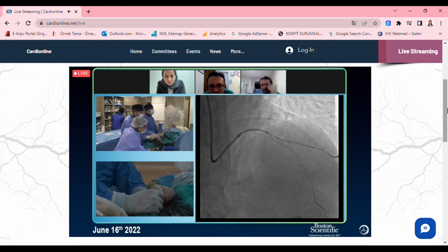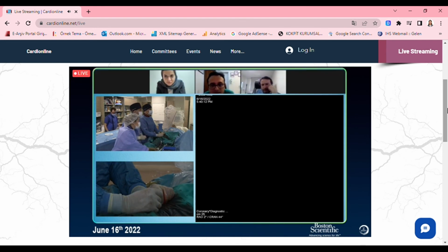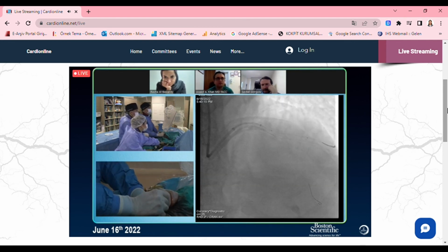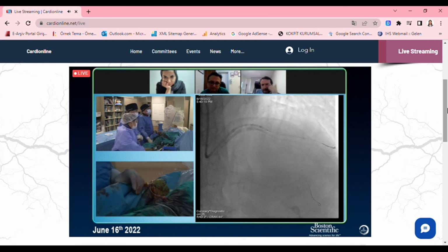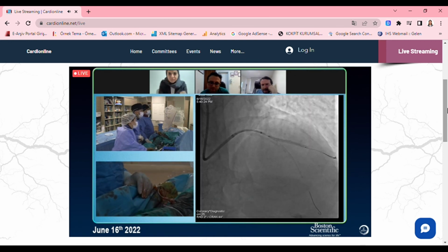Mini clot. I'll do mini clot, yeah. Yes, yes. So go up more. Okay. Go 18. 18, yes. Yes, good opening. Okay.